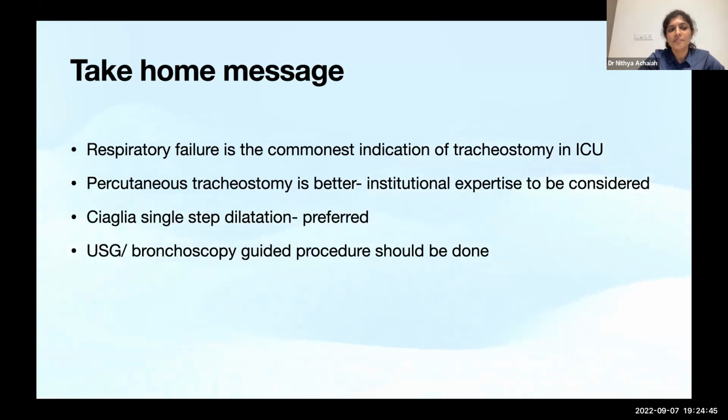Preferably do the tracheostomy under ultrasound guidance or bronchoscopy guidance. Nowadays more and more institutions are using bronchoscopy guidance over ultrasound guidance, but both have equal complication rates, and there is no benefit of one over the other as per the literature.